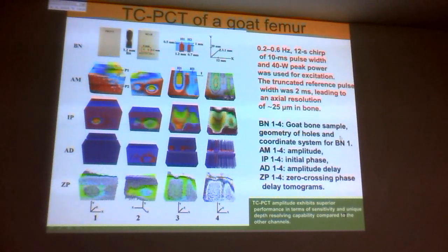You cannot make a time t equals 0, because if the slice is t equals 0, then there's no energy there, so your signal goes down. So you have to have a certain width of the slice. The narrower the slice, when you do the cross correlation, the more heavily depth resolved your response is, because you're picking up heat at that depth. There is no diffusion coming out. Whatever heat is there, you're picking it up at that depth. That's why now you can do depth profilometry.